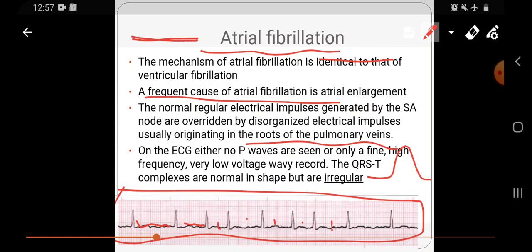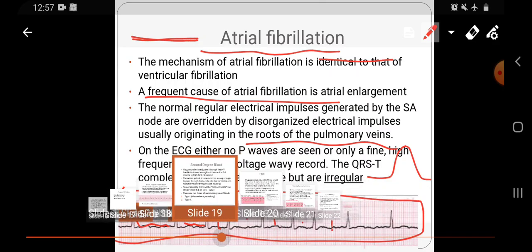طيب هلا بالنسبه للكيو ار اس كومبلكسز رح يكونوا موجودين they are there. ممكن التي ويفز يكون صعب انه نميز وين هي موجوده لانه اصلا الامبليتيود لها بالعاده ما بيكون كتير عالي مش زي الكيو ار اس، بس الكيو ار اس جدا واضحه.